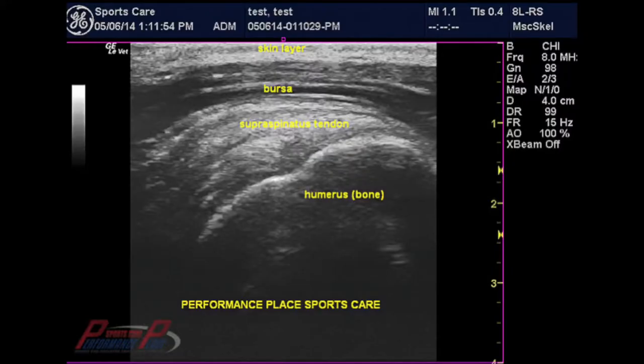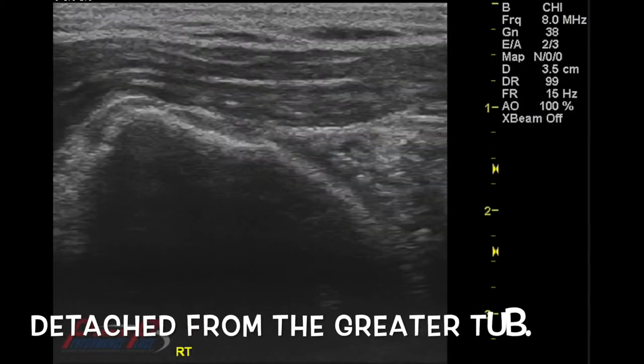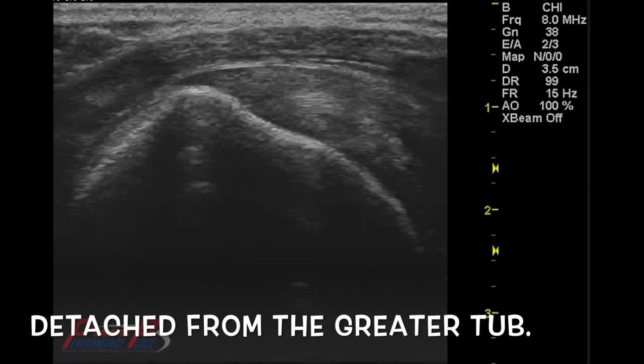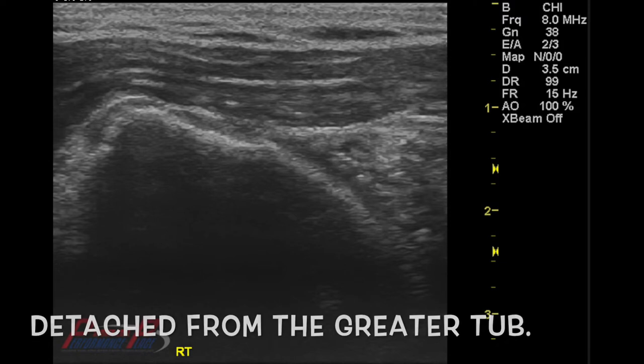Today we have an interesting shoulder case that should really help demonstrate how MSK ultrasound can help out healthcare providers in diagnosing shoulder cases much easier and more accurately. This is a shot of a normal rotator cuff, a normal supraspinatus. So here we have a normal and we have an abnormal. We'll show you the normal and then we'll go with the abnormal — it's a very blatant difference.